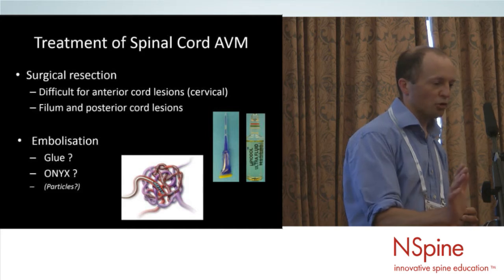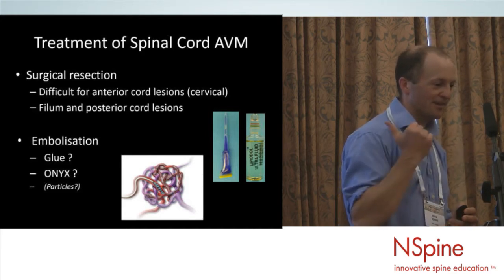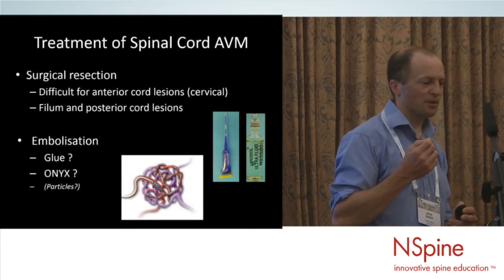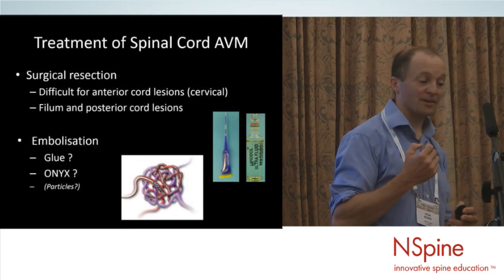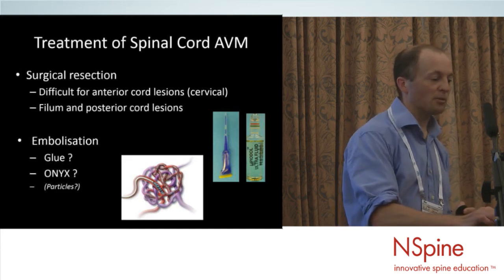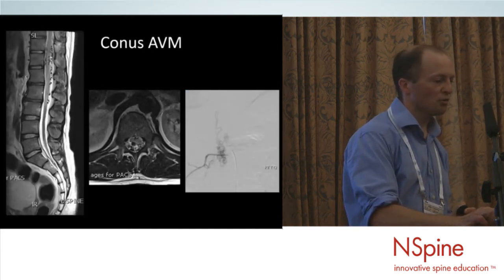I'm not going to talk at all about surgical resection, it's been nicely covered, but I think I agree in this slide to what you talked about a little bit. I've mentioned already about the embolic materials. Glue would be my preference. Onyx would not be my preference, although some operators swear by it. Particles, occasionally people talk about particles, I think it's lunacy, so we wouldn't use any of those, as I put it very small.